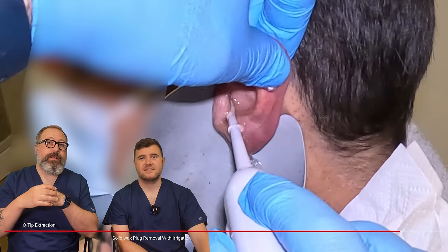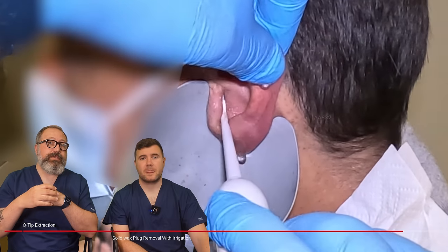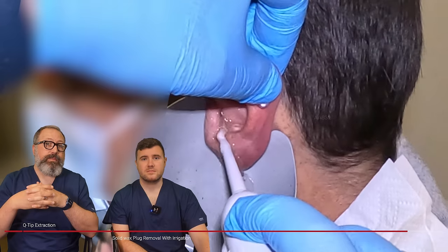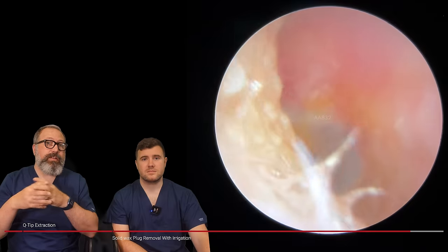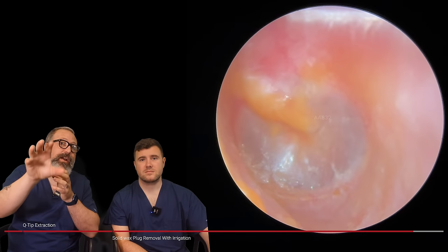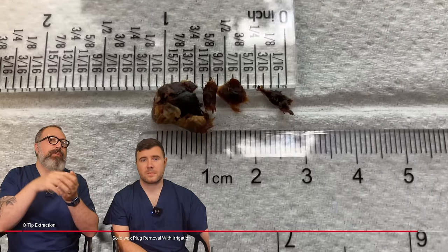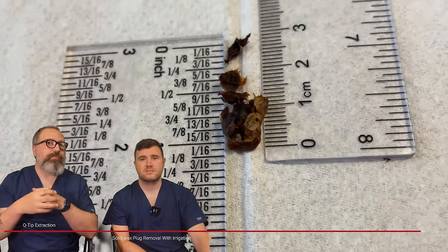So we've got most of that out — that was literally a couple of minutes, two minutes max. Within the first sort of 20 seconds you started getting really, really big old plugs out there. That's it, I don't think there's any more coming out. Look at the ear canal afterwards — look at the difference there compared to what it was. This was matted, thick, sticky wax everywhere, and that ear canal is now completely clear. There was a little bit of pinkness at the back of the canal — I think that's just because of the temperature of the water bringing the blood vessels up. But I would always advise that patient to use a little bit of ear calm afterwards, just prophylactically, to make sure it doesn't trigger off infection or anything like that.